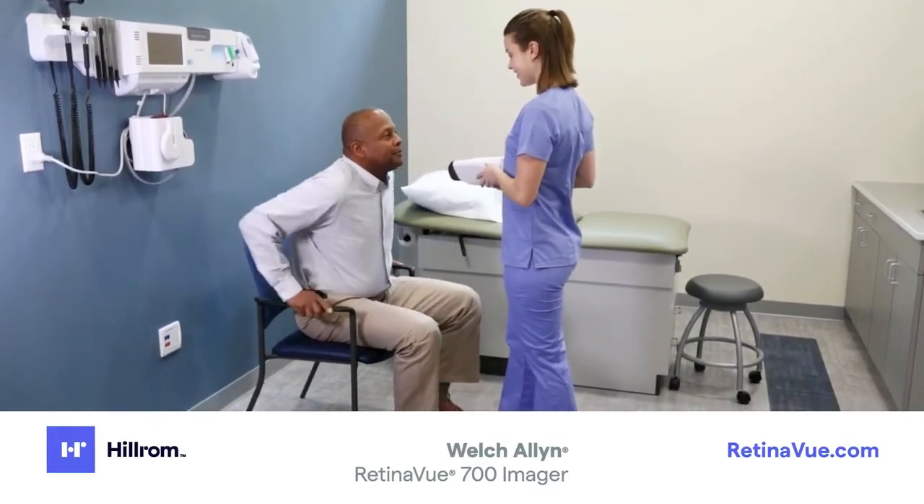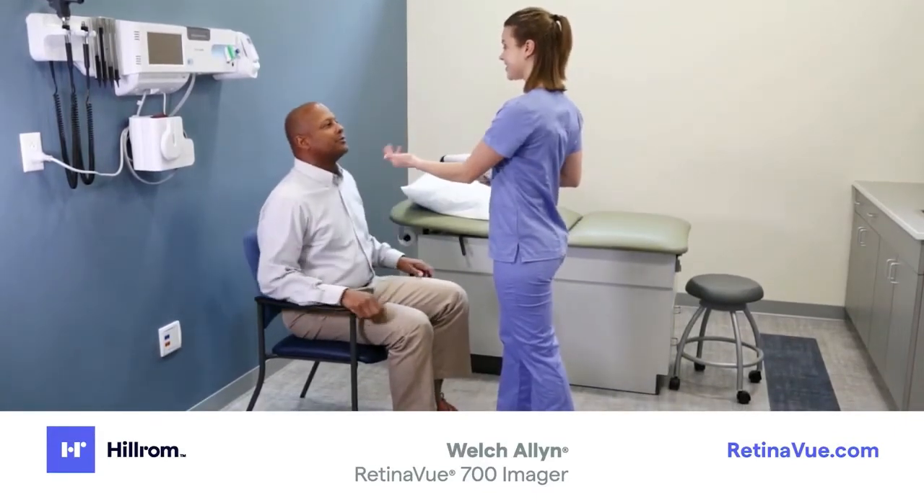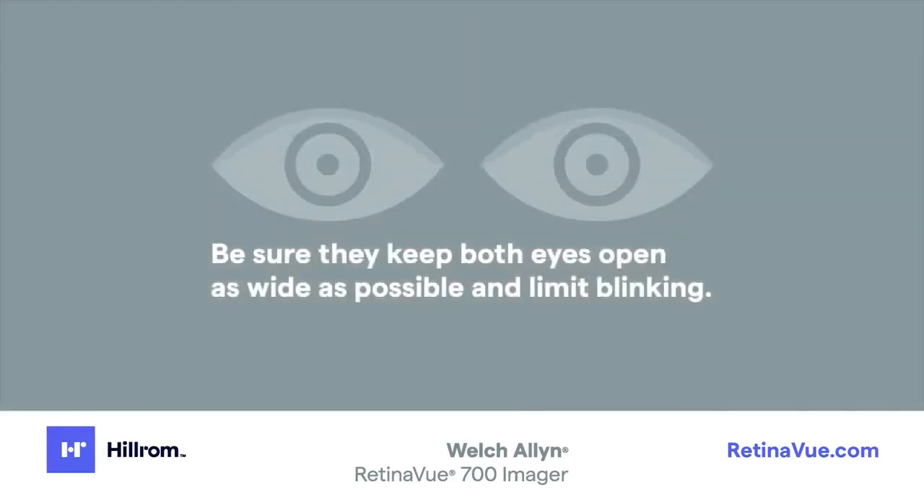Direct the patient to sit up straight. It is recommended that the patient sit in a stiff back chair. Instruct the patient to look forward and hold their head still. Be sure that they keep both eyes open as wide as possible and limit blinking.